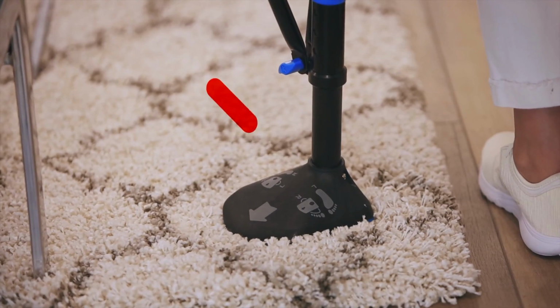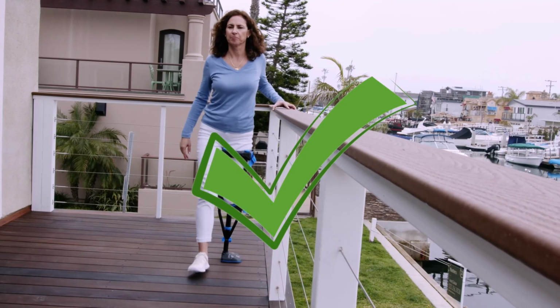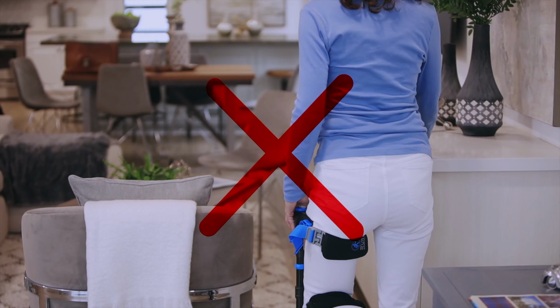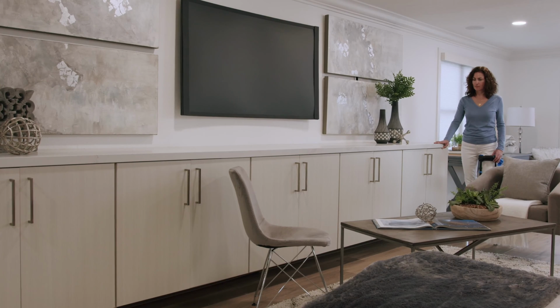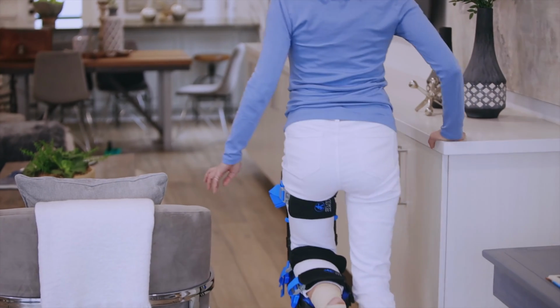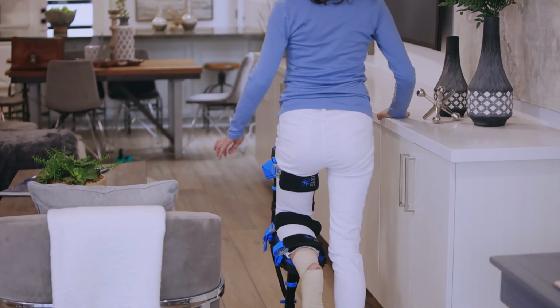Pick a location with a hard, flat surface. Avoid carpet and uneven terrain. Choose an area that's free of obstacles that will allow the patient to take 10 or more steps without stopping. Make sure there's a wall, rail, counter, or similar that the patient can use if they need help balancing.